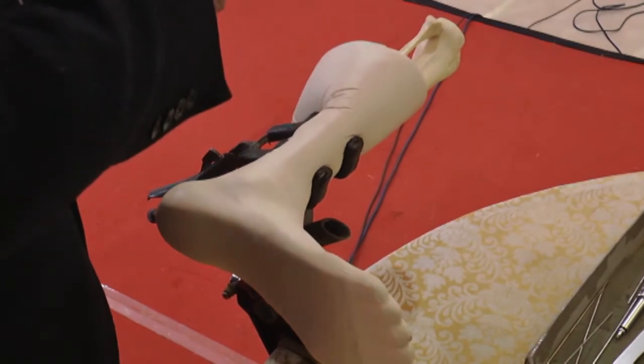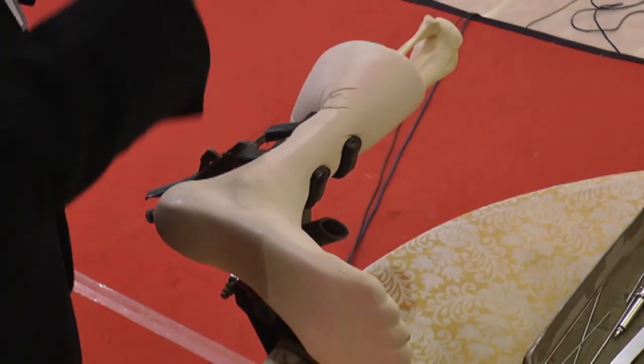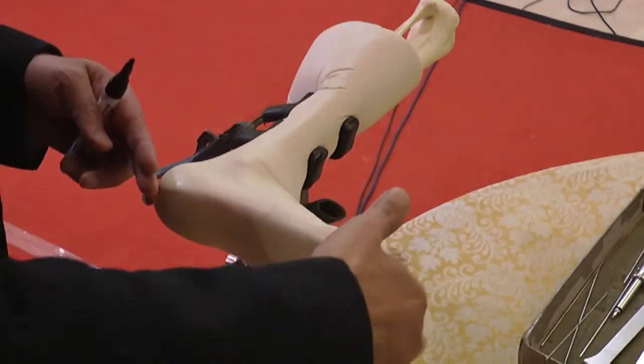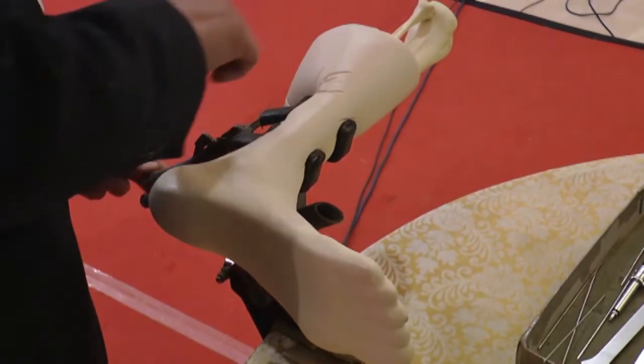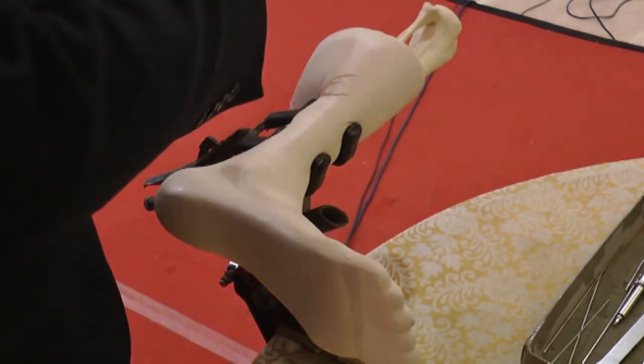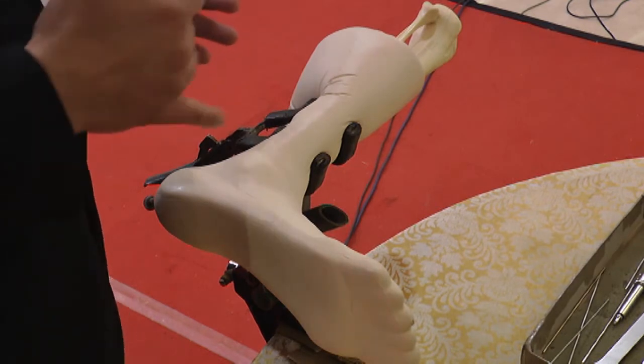So when you're bringing the C-arm in, you see the lateral view like this, and you rotate the C-arm in this direction and slightly dorsiflex to take the axial view. And because this is fixed here, but your leg is free, you can rotate the leg to take the Broden's view while the C-arm is lying like this.